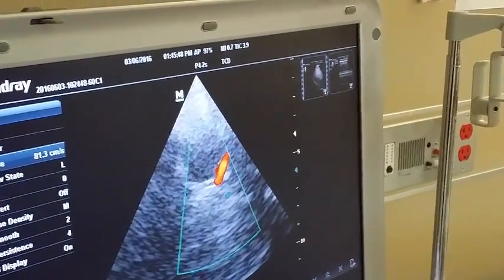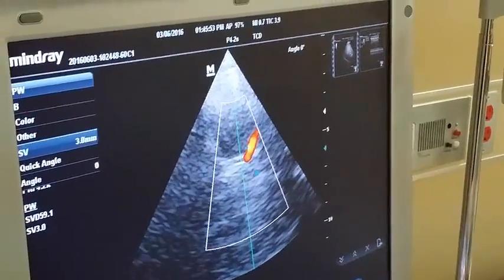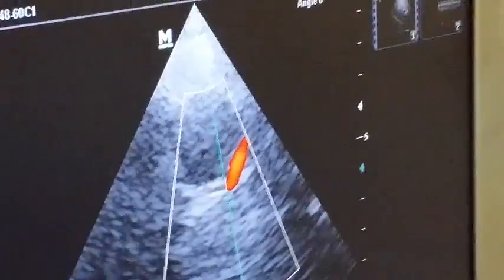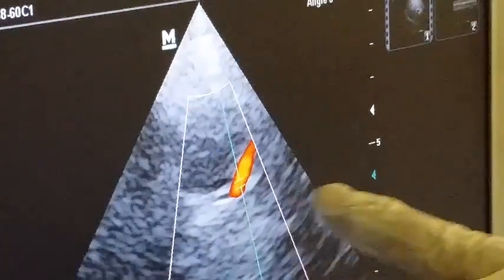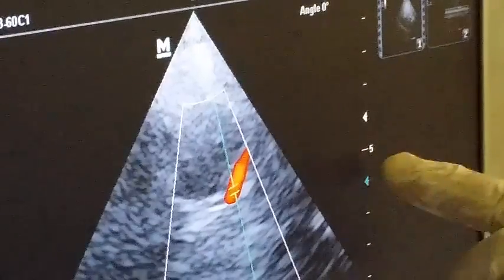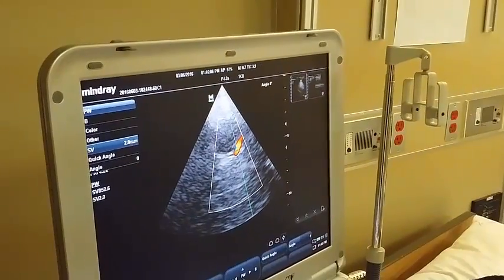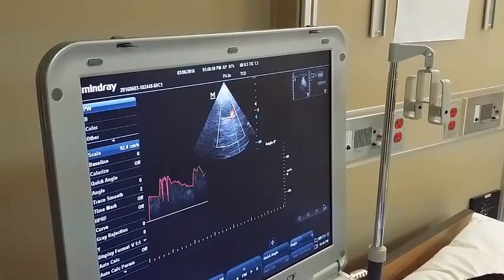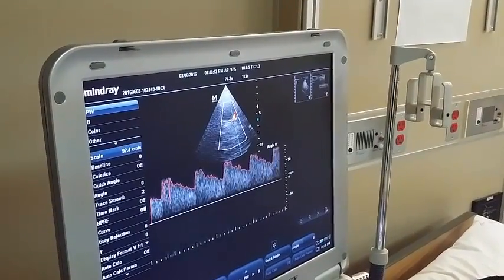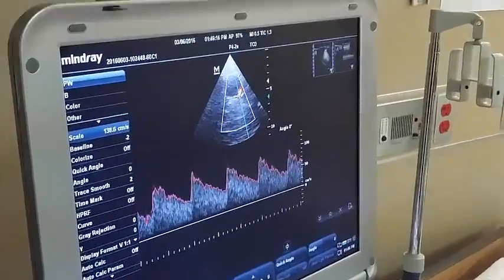Once you get this amazing good view of the right side middle cerebral artery, you will activate the pulsed wave Doppler. You will adjust it at the center of the screen. As you see, the middle cerebral artery is almost at 5 to 6 cm from the skin, which is very important to determine the position. After that you will fire the pulsed wave Doppler and you will get this amazing picture of very good flow.